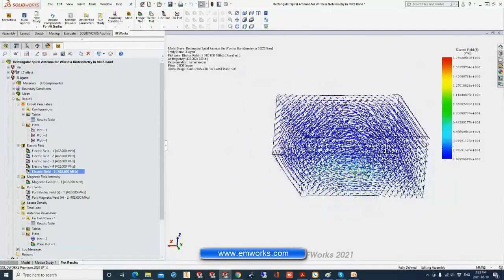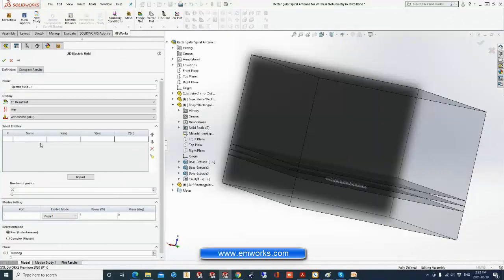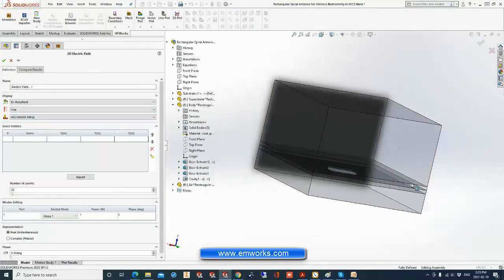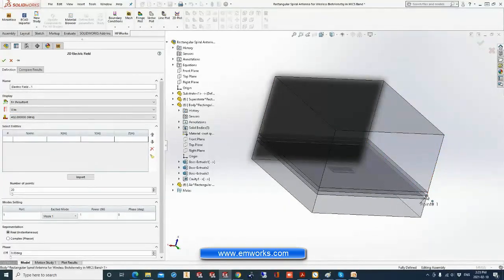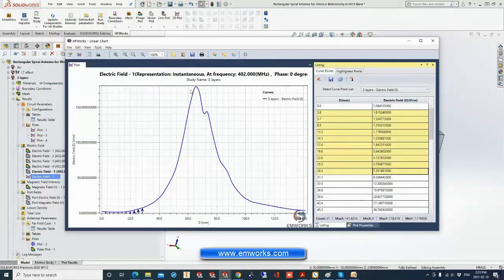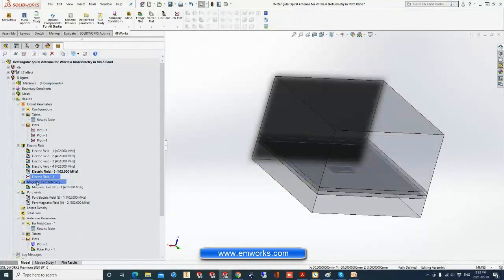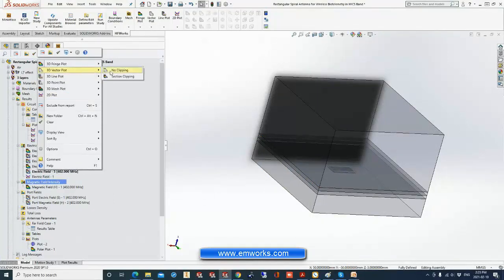Not only colors, you can also check the values of the electric field. For example, you can make a 2D plot of the electric field at a certain location, from this corner to this corner, a straight line with this resolution. Here you choose 51 points from point 1 to point 2, a straight segment. And this is the electric field from point 1 to point 2. We have here the list of the electric field, a peak in the middle of 65 volts per meter. The same thing can be done to see the magnetic field also.